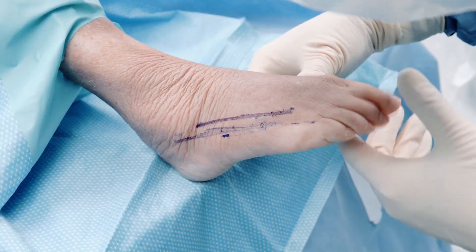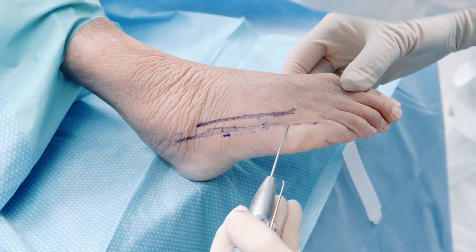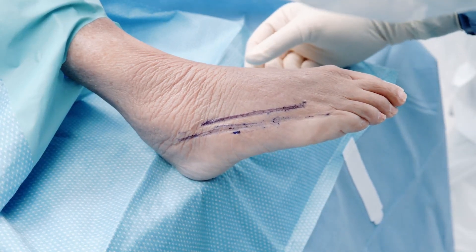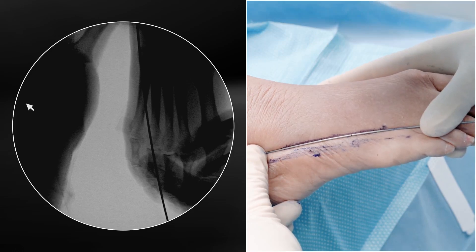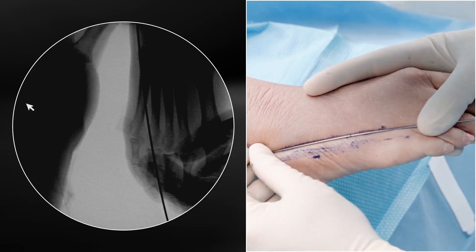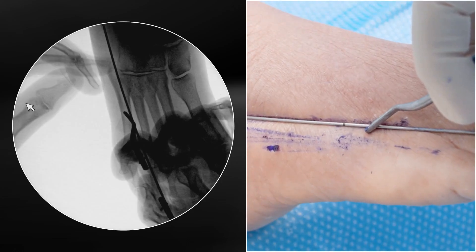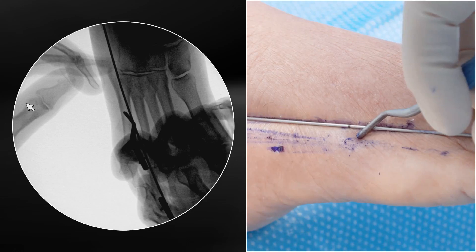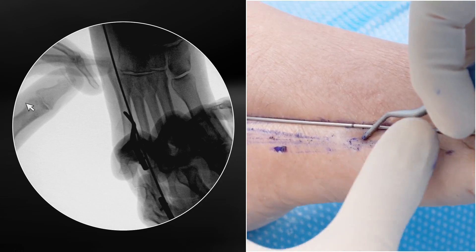I'll show you an alternative fixation method. Here we've marked the trajectory of the 5th metatarsal in both the lateral plane and the AP plane, and I'm going to use that as a rough guide for where I'm going to do my fixation. This is going to be the trajectory of my screw — going right through the 5th metatarsal styloid. I'm going to make my osteotomy where the wire crosses the medial cortex, roughly here, more proximal — before the watershed zone of a zone 3 proximal 5th metatarsal — but proximal enough to get a good level of correction.